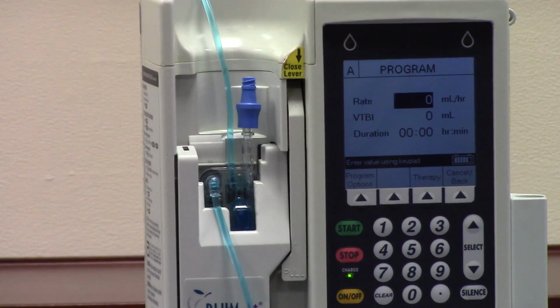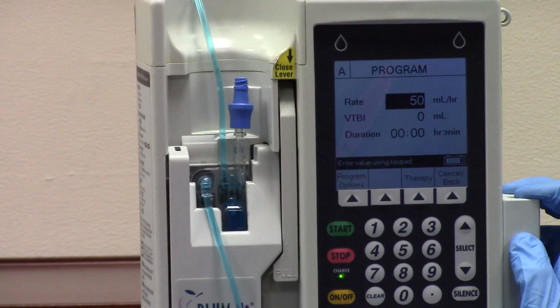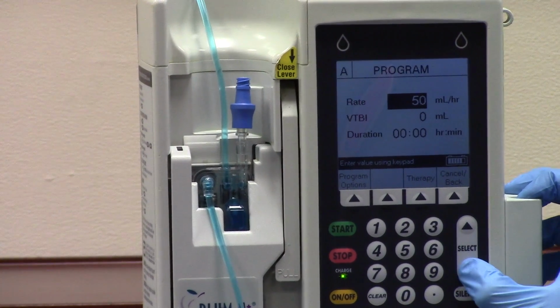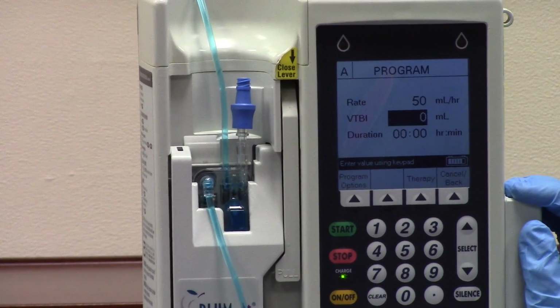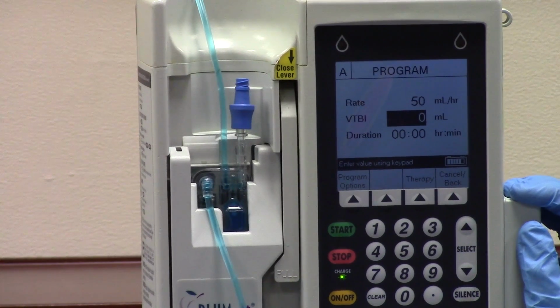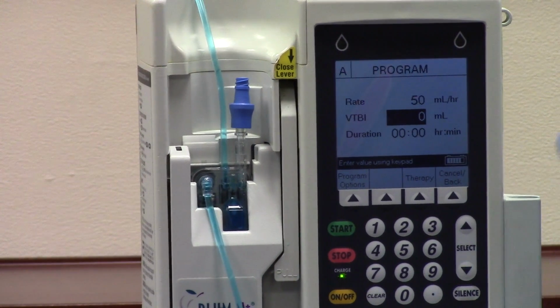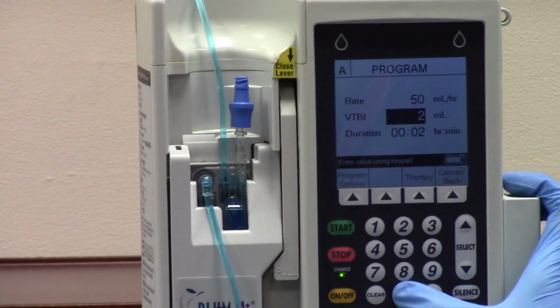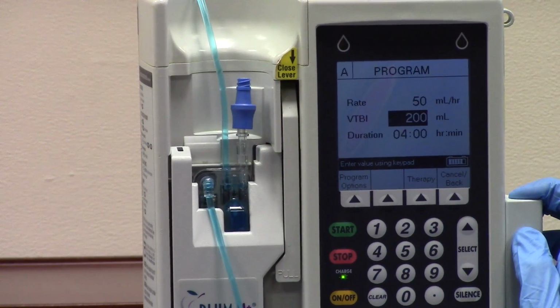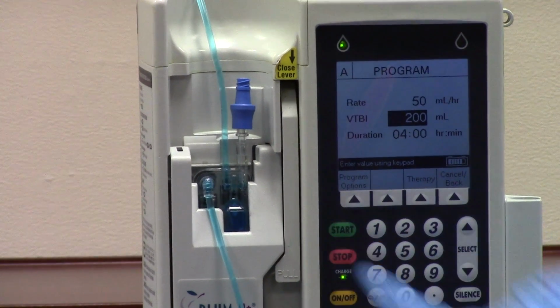Now it gives me the option to program a rate, so we'll pick 50. I use my arrows. VTBI is volume to be infused. So how much fluid do I want to go to the patient? So we're going to say I've got about 200 left, so we'll say 200. And then start is green. Start.